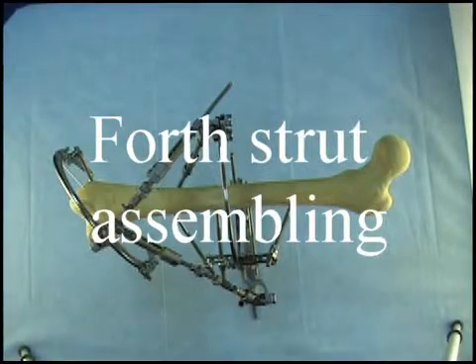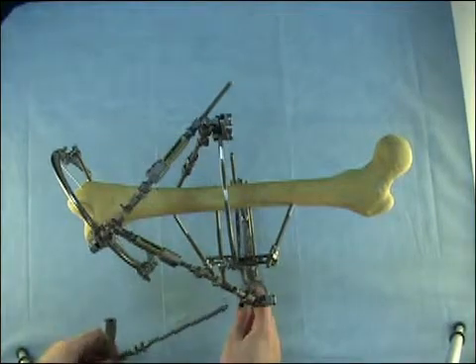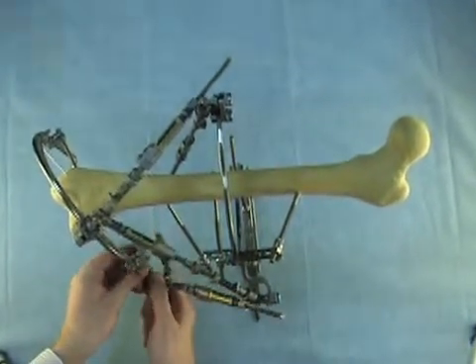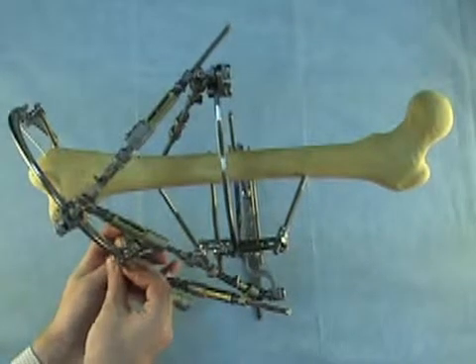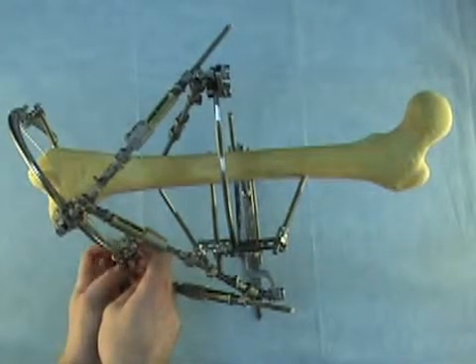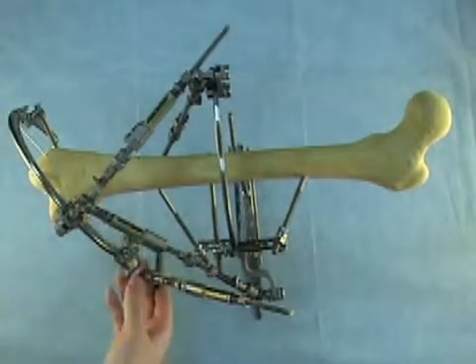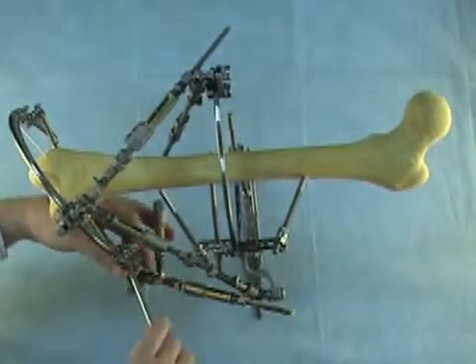Now we attach strut number four to the distal ring, also preassembled with a Z-shaped plate. First we insert the threaded rod of strut four into the strut length changing unit of strut number three. Then we fix the Z-shaped plate to the ring by a knot and a bolt. Pay attention: when fixing strut four's Z-shaped plate, we direct it below the ring; when fixing strut three's Z-shaped plate, we direct it above the ring. This gives us more space. We fix this connection by 12mm wrench.